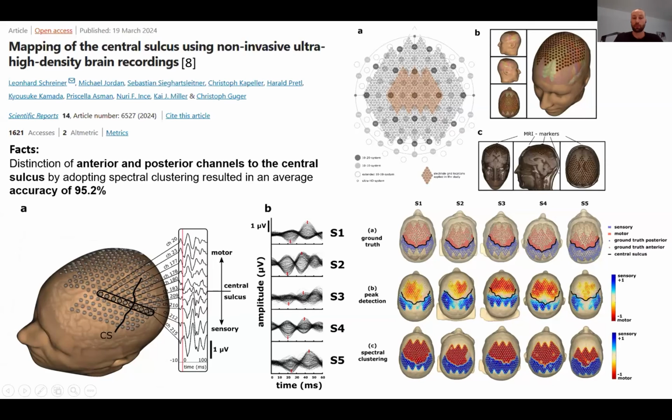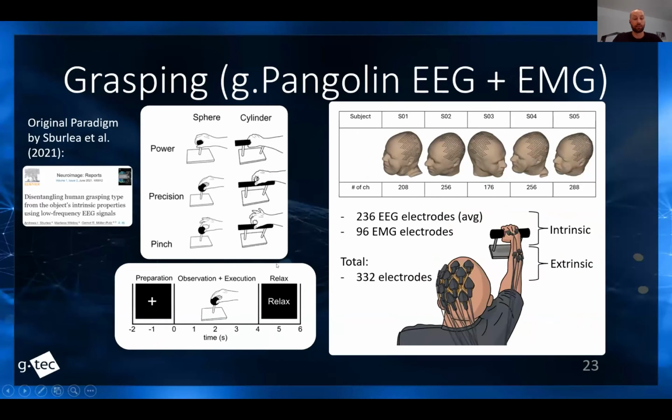So with that, with a short intro, I can hand over to Pauline, and I will switch on my camera and work here with Patrick on this visual experiment. And when Pauline and Matteo did their presentation and they give me the go, I will start my experiment here and do a live stream of the measurement. I will just now switch on the camera.